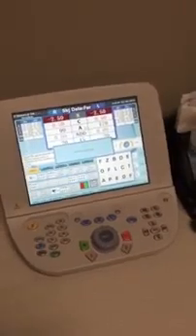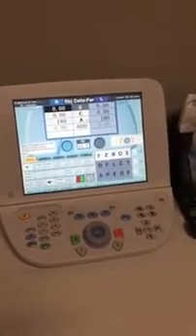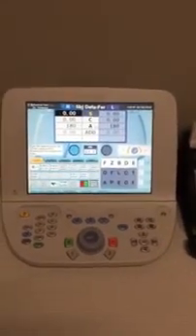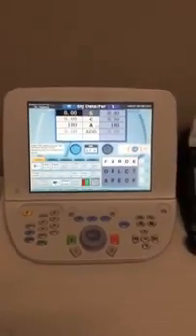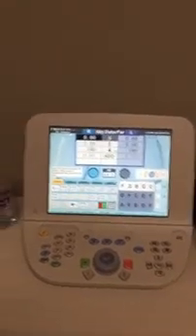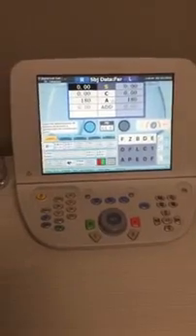You need to clear out the information on every new patient, or I should say every time you want to input new information. Otherwise the Phoropter is not going to go through the steps properly. Again, the staff member working up the patient should clear out that information first before inputting the new information.